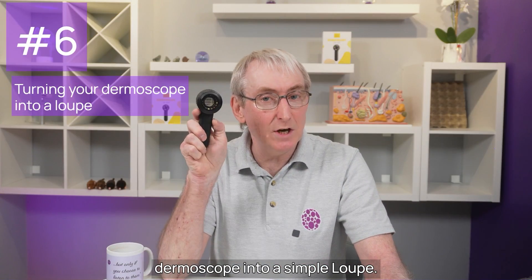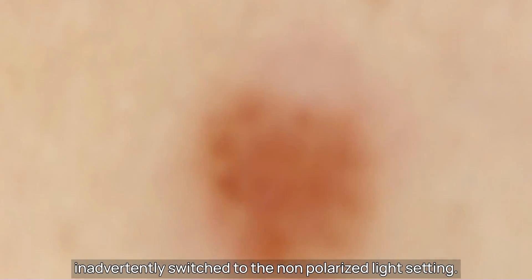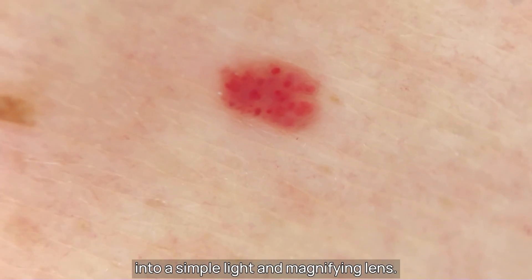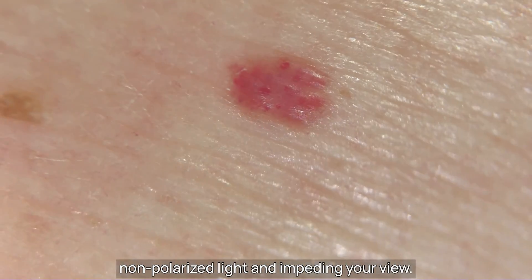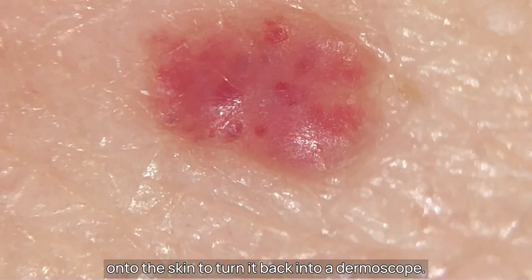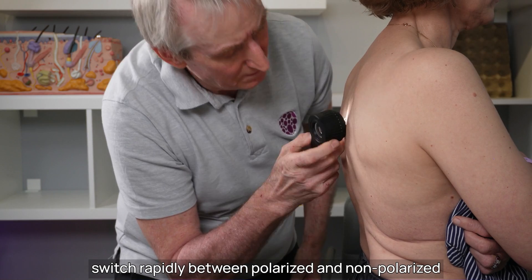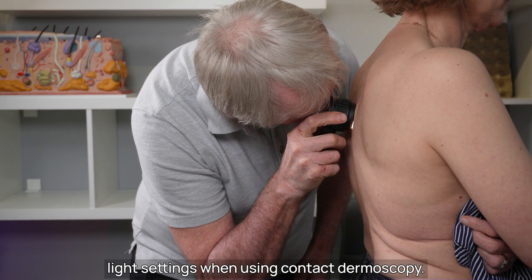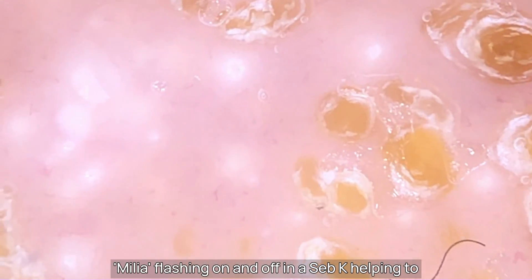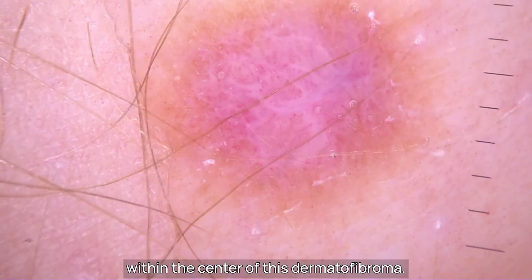Mistake number six: turning your dermoscope into a simple loupe. When using polarised non-contact dermoscopy, you inadvertently switch to the non-polarised light setting. Congratulations — you've just turned your expensive dermoscope into a simple light and magnifying lens. The stratum corneum is now scattering the non-polarised light and impeding your view. Either switch back to the polarised settings, or extend that face plate with a contact medium onto the skin to turn it back into a dermoscope. The advantage of a hybrid dermoscope is being able to switch rapidly between polarised and non-polarised light settings when using contact dermoscopy — but this only works using contact dermoscopy. Then you can get images showing milia flashing on and off in a Seb-K, helping to confirm its benign nature, or shiny white structures within the centre of a dermatofibroma.